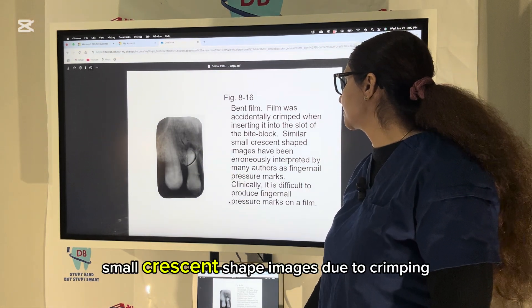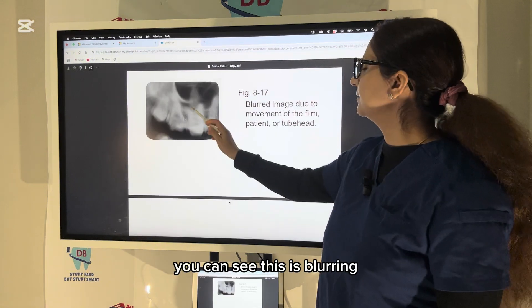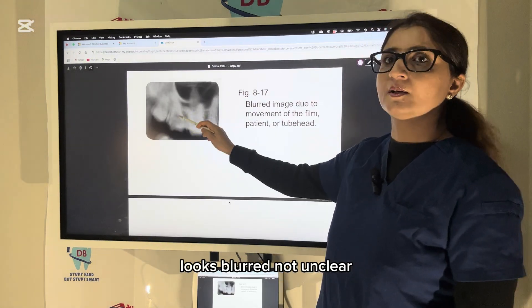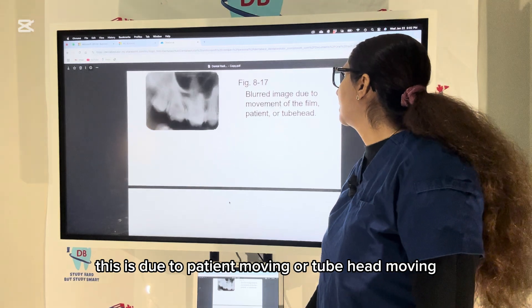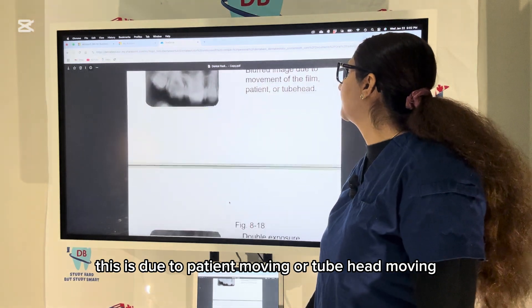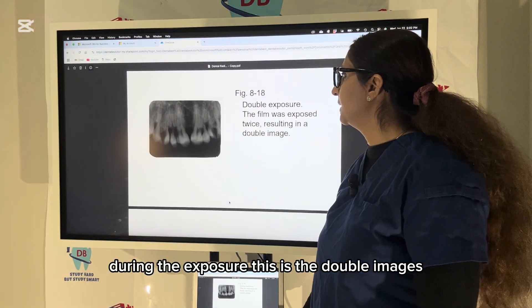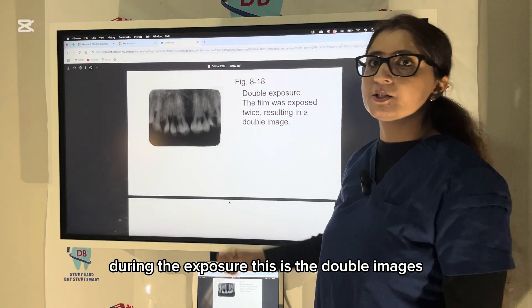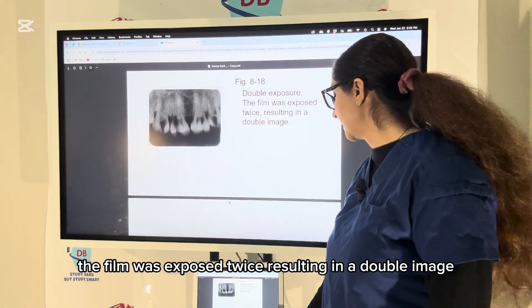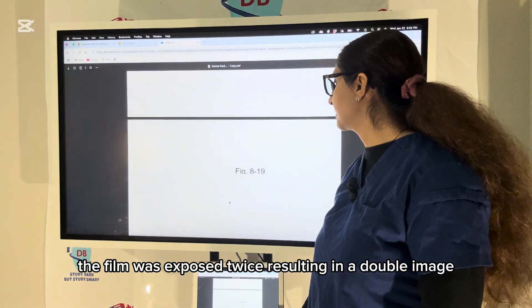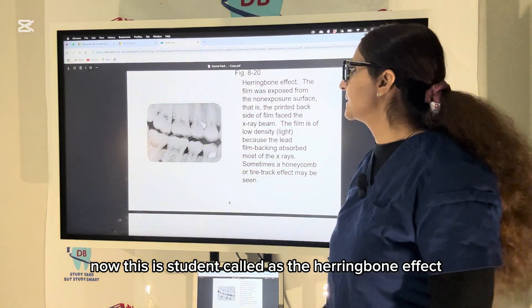Small crescent-shaped images are seen due to crimping. This looks blurred — not unclear — due to the patient moving or the tube head moving during exposure. This is a double image: the film was exposed twice, resulting in a double image — also called double exposure.